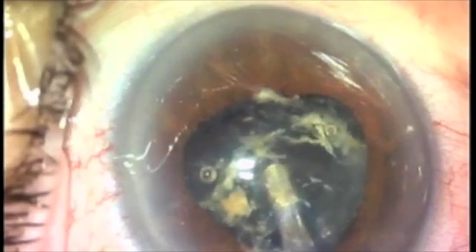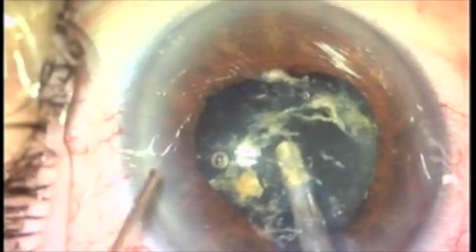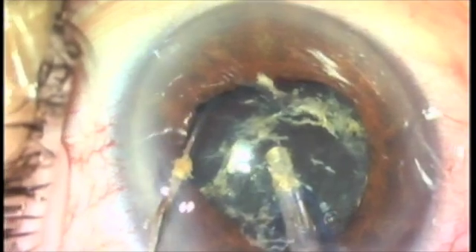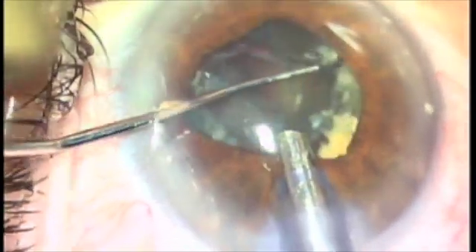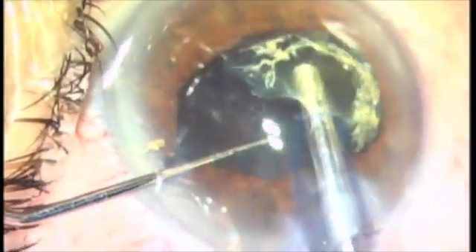I impale the nucleus with the phaco tip, pulling it out of the lens bag. Now I'm going to squirt viscoelastic behind this nucleus in order to push the posterior capsule back, and it will hold the nucleus up in the iris plane.